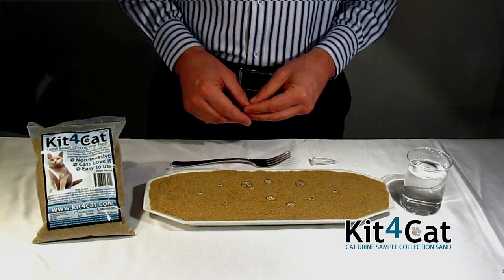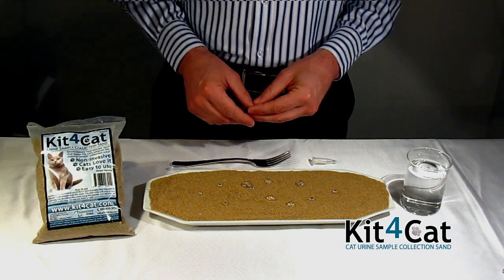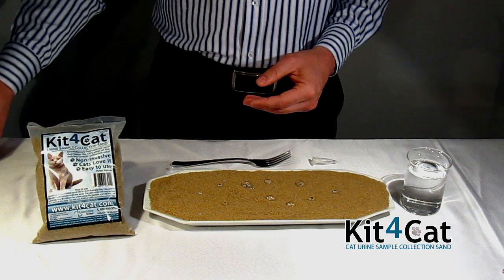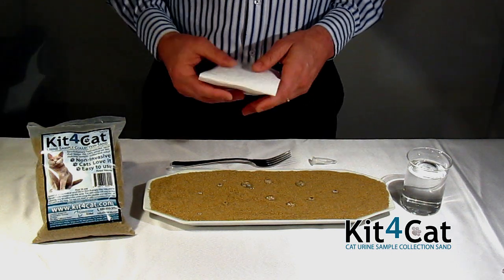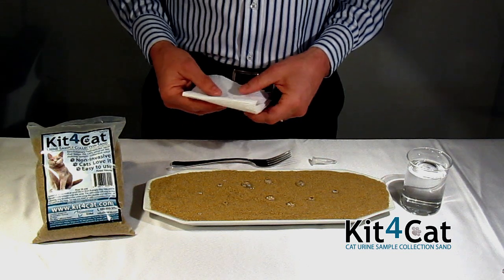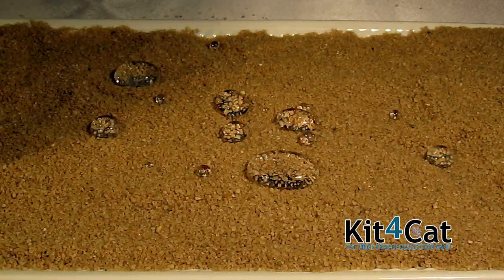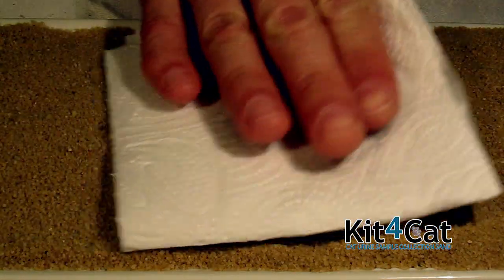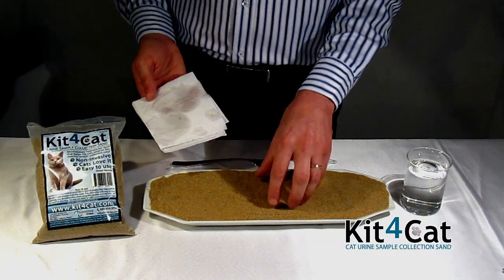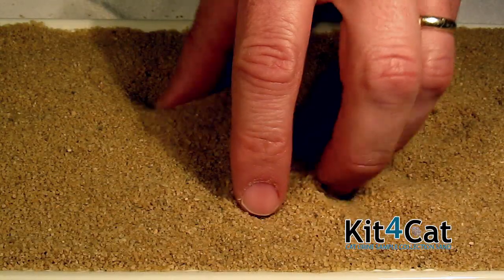Kit4Cat is great when dealing with diabetic cats or cats that have kidney problems. Both require taking multiple samples. Just by using a paper towel, you can get exact measurements of how much the cat urinated, or take multiple samples from the same cat using the same sand. As you can see, the paper towel has absorbed the urine entirely and the sand is completely dry.